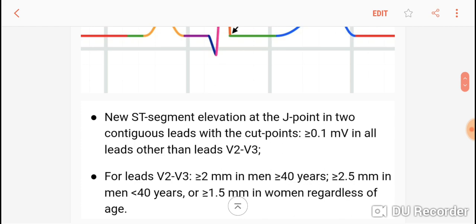A STEMI would be a new ST segment elevation at the J point in two contiguous leads. It is more than 0.1 mV, or one small box on the Y axis, in all leads other than V2 and V3. Contiguous leads means leads of a particular area of the heart.